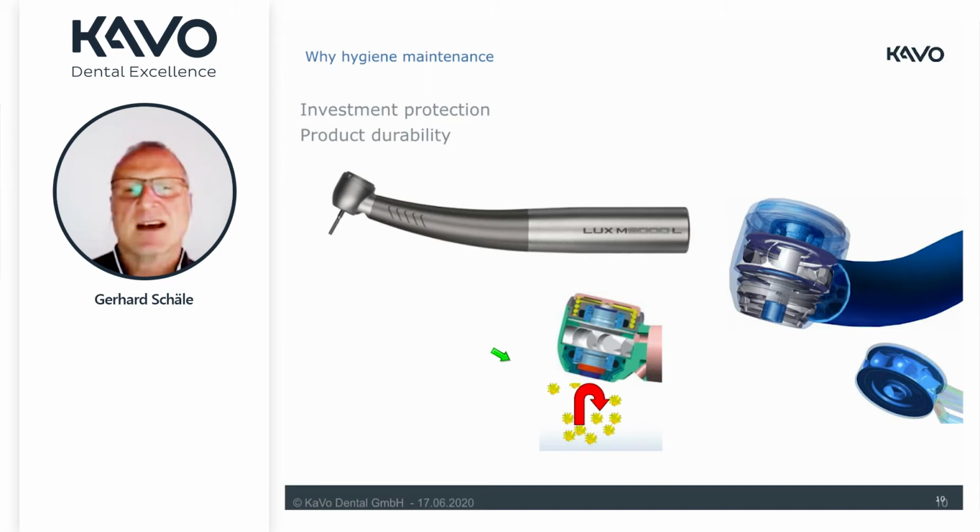And exactly this time we reduced to less than 1 second. This is just a mechanical system. The rotor will be stopped automatically within 1 second, and as an effect we have no suction into the inside of the cartridge. This is very important, not only because of contamination, but also because we want to avoid the influence of mechanical damage.